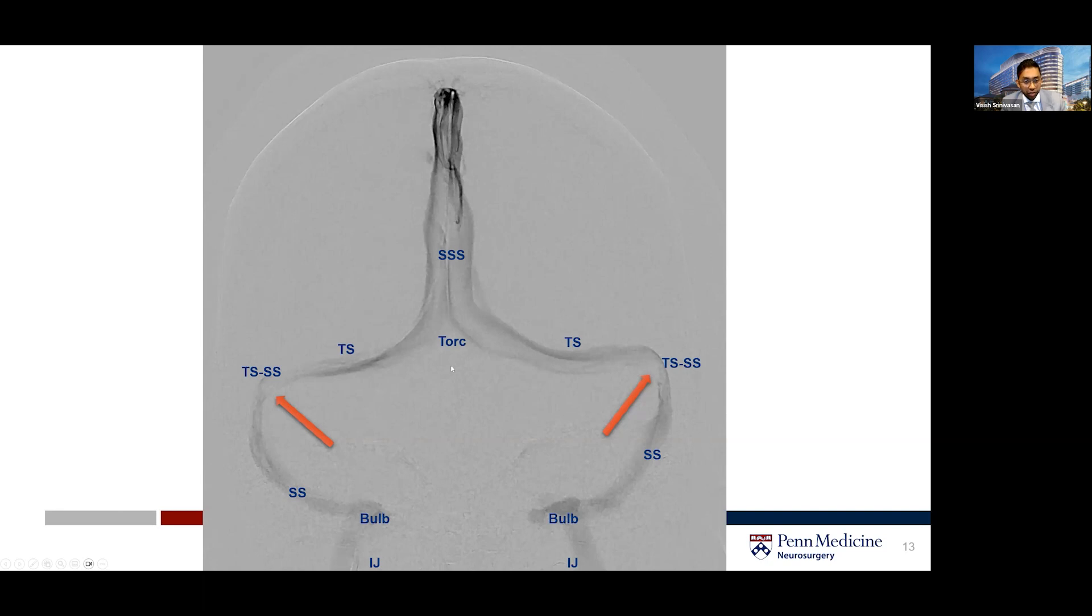You can see flow coming down the superior sagittal sinus across the torcula to the transverse sinus across the transverse sigmoid junction, where in this particular case we're seeing bilateral stenoses down to the sigmoid sinus, the jugular bulb, and the internal jugular vein.